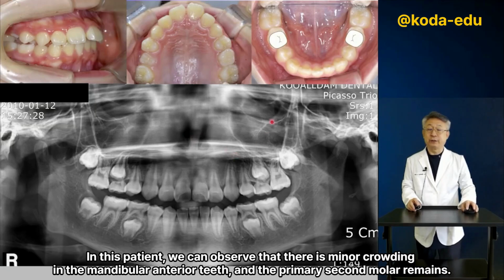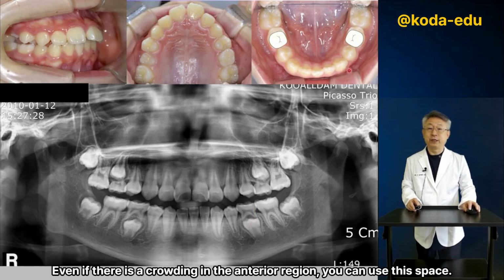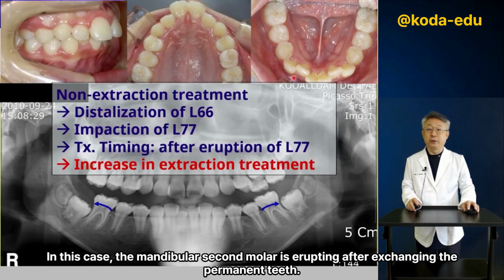In this patient, we can observe that there is minor crowding in the mandibular anterior teeth, and the primary second molar remains. As you know, the erupting second premolar is smaller than the primary second molar. Even if there is crowding in the anterior region, you can use this space. In this case, the mandibular second molar is erupting after exchanging the permanent teeth.